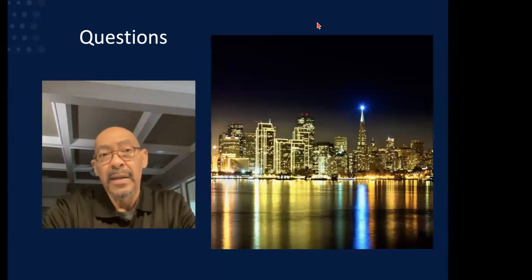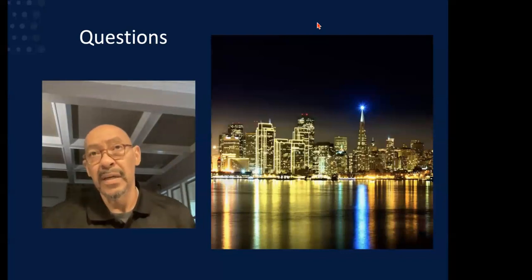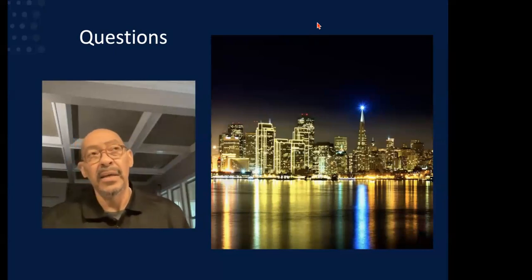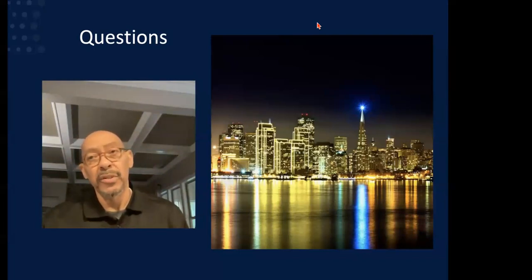I would say that if you have something go wrong, we have to resolve what that issue was. And the biggest of the biggest is a vitreous break. And either the doctor, if he's outside the U.S., can do a vitrectomy and fix that, or if he's inside the U.S., and I think Canada is set up very similar to the U.S., that patient would have to be referred out to a specialist, a retina specialist, to take care of it.